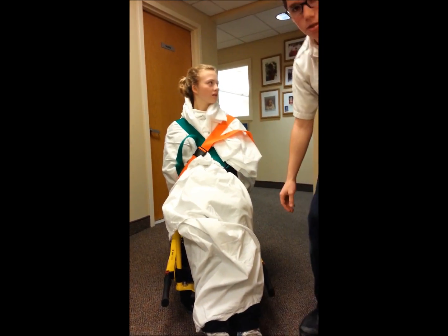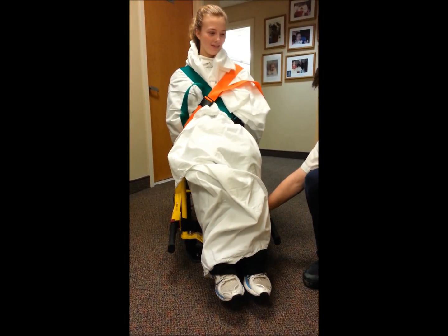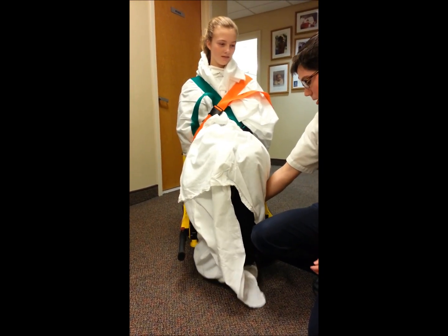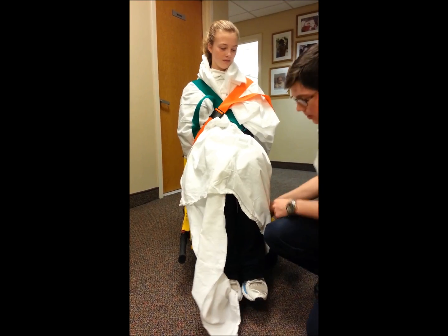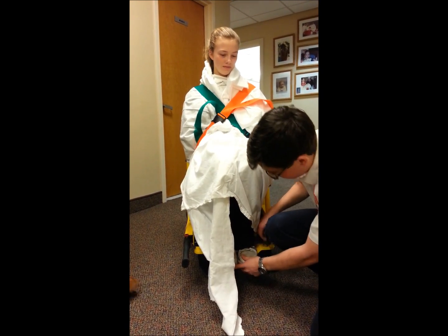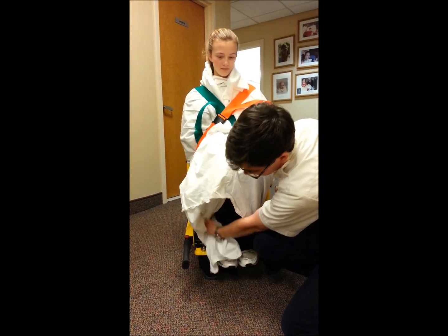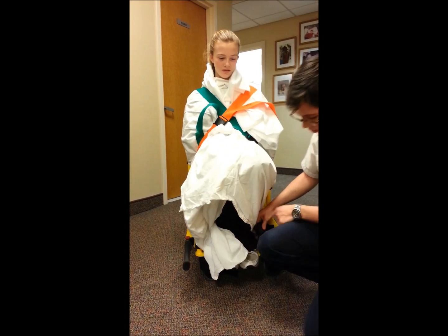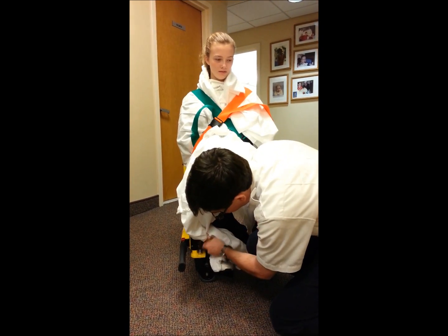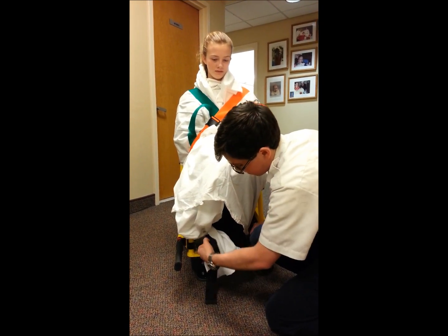Then you want to make sure that their feet are up on this little bar here — just put your feet right up there. As you can see there's a little buckle right here, so you can buckle their feet in so they don't catch when you're trying to move them.